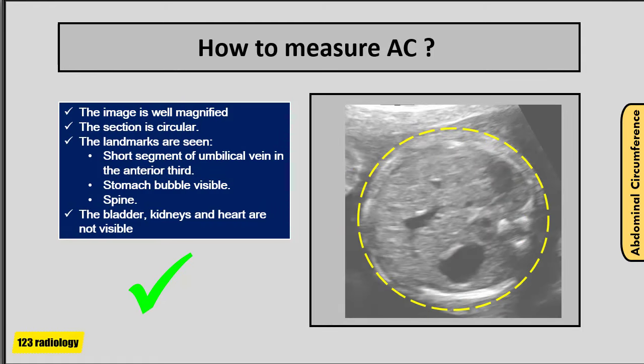Magnify so the cross-section of the fetal abdomen fills at least 30% of the monitor, and do not distort the circular shape by applying too much pressure with the transducer. This is an example of correct abdominal circumference measurement: the image is well magnified, the section is circular, landmarks are seen — short segment of umbilical vein in the anterior third, stomach bubble visible, spine at 3 o'clock — and the bladder, kidneys, and heart are not visible. The ellipse calipers are well placed on the outer skin surface.